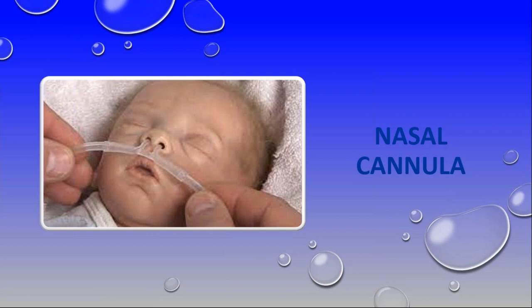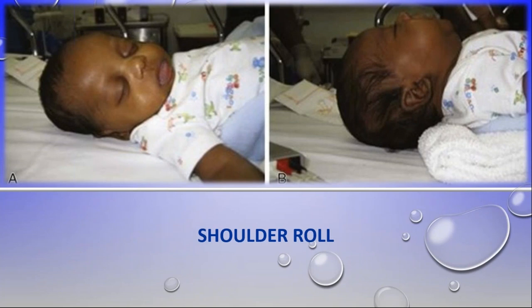This is the shoulder roll. It is important that the shoulder roll is in place for you to resuscitate. Look at the way this baby's lying here versus lying here. This airway is opened, this airway is collapsing. And how have they done it? Please notice the shoulder roll. There's actually two here if you look carefully. There's this one and that one. And that puts the baby's face into the neutral position, or what we call sniffing the morning breeze. Do not overextend it, just put it in.